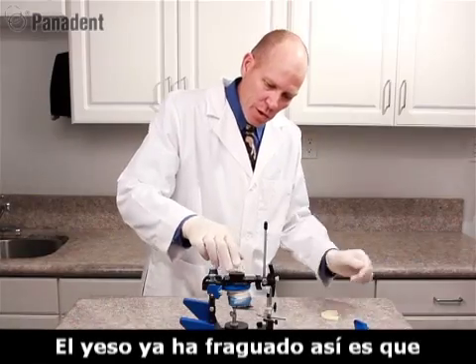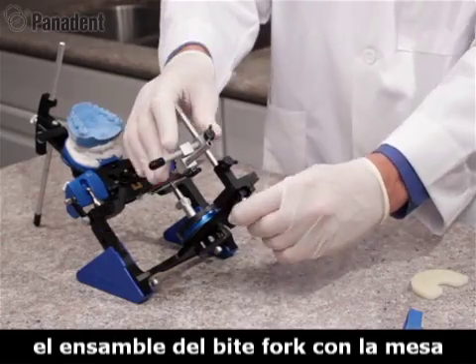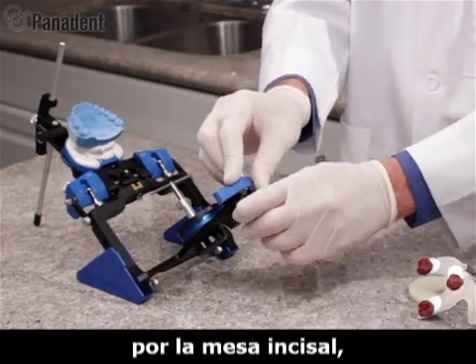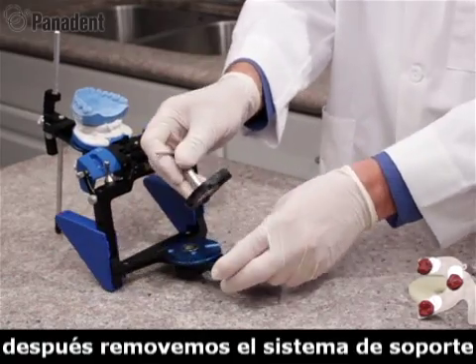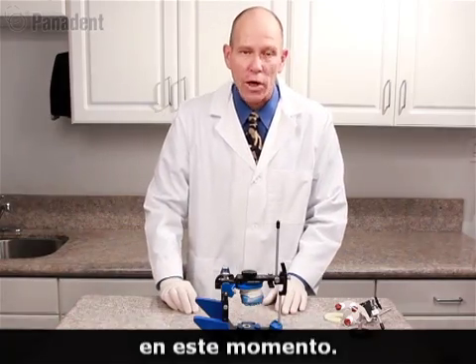The plaster is now set, so we swing the articulator open and remove the bifork assembly with the mounting fixture, replace the incisal table, and remove the bifork support system. We can now go ahead and prepare for mounting the lower cast.